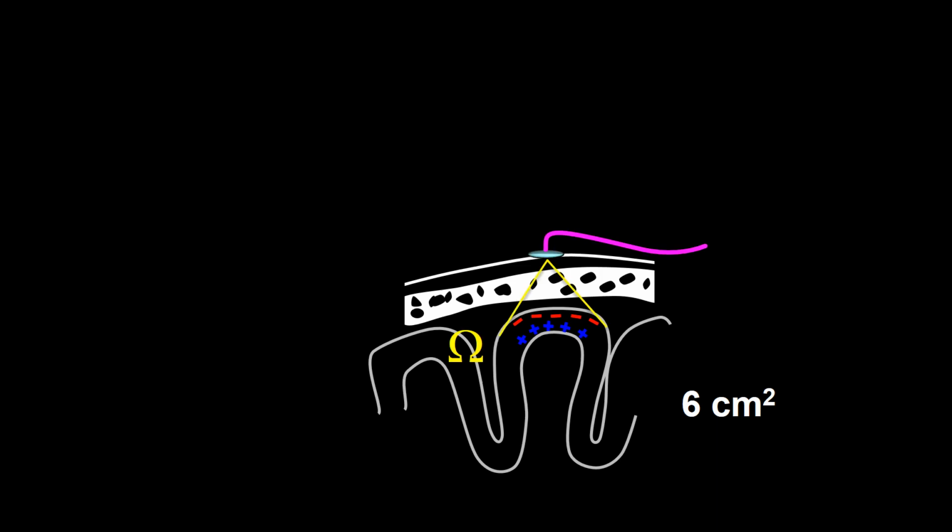In this frame, I have added an electrode right on top of the crown of the gyrus and the solid angle perceived from that electrode. In this case, there is only one angle, represented by the yellow omega, and this angle is equal to the effective angle, that is the effective solid angle, represented as the green omega sign. Now I will introduce a voltage line chart.